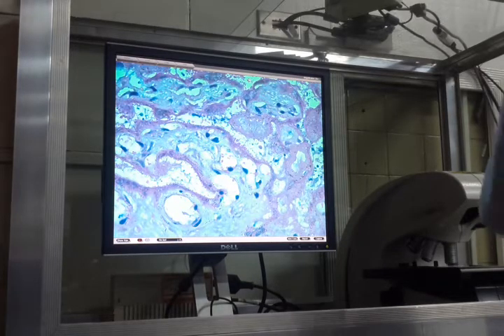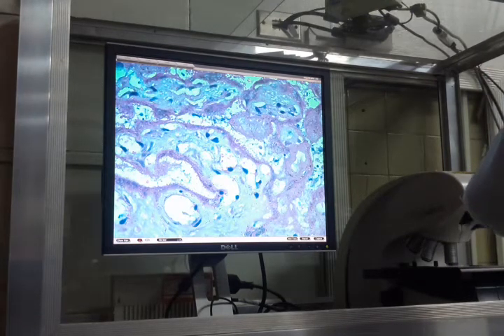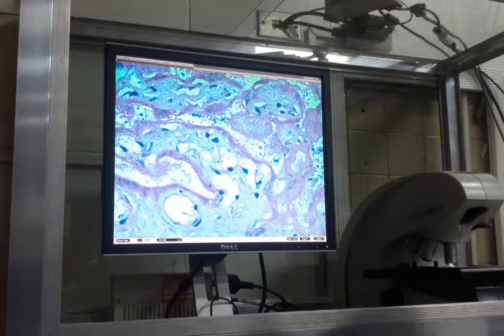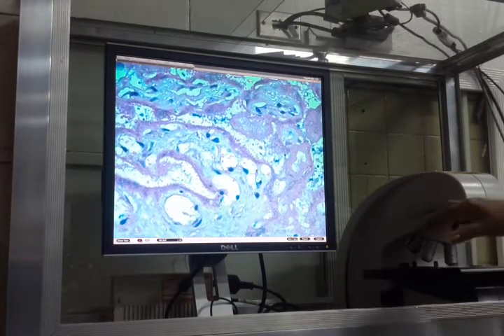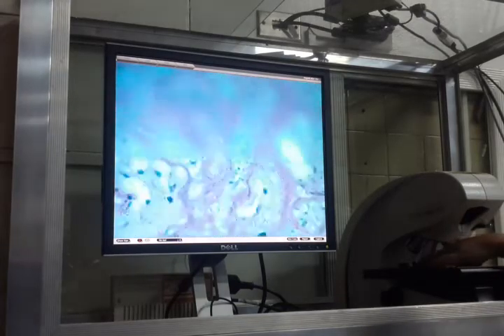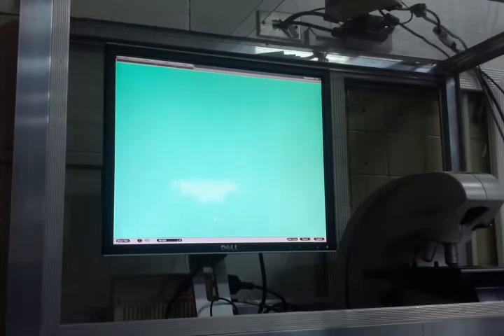Tama? So, itong chorionic villi na to, pagka ang tinanong sa inyo, hemodynamic question, white infarct siya. Okay? Ang cause pa rin niya, hypoxia, and you have coagulation necrosis. So, bahala na yung gagawa ng tanong kung saan niya isisingit yung ito, kung saan niya ito gagamitin. Kung gagamitin niya itong slide na to. May tanong kayo dito? Wala naman, no? Sa inyo, pwedeng side question lahat ang itanong.